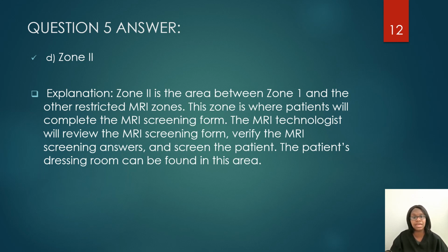Ask them if a stimulator was placed, if they've had a stimulator taken out. Ask them if they still have the leads in there, because the leads may not be safe anymore or may not be MRI conditional. So you have to go back over the screening form, especially if a patient is a diabetic. Sometimes they forget to remove the diabetic glucose monitor from their arm or their stomach. They may have a medication patch on that is not safe to go inside. They may even have hearing aids.